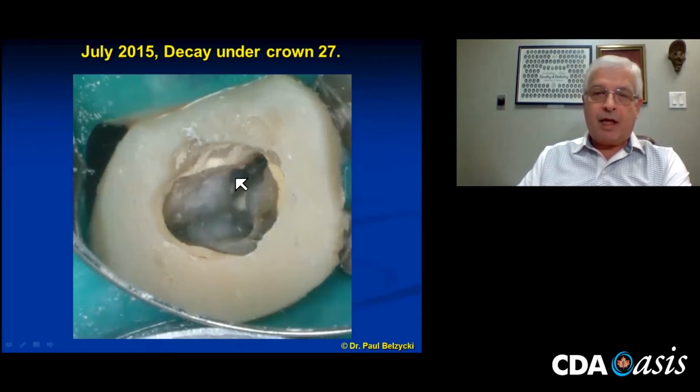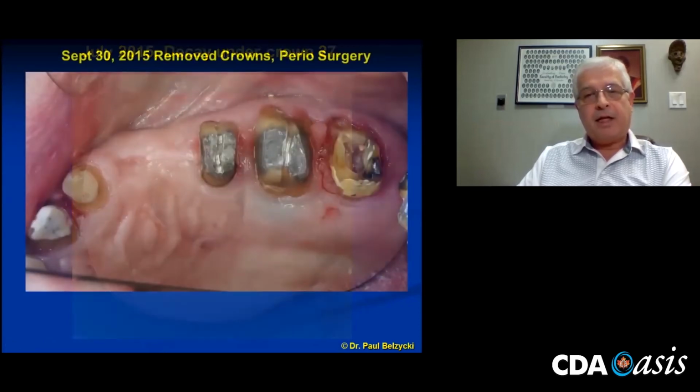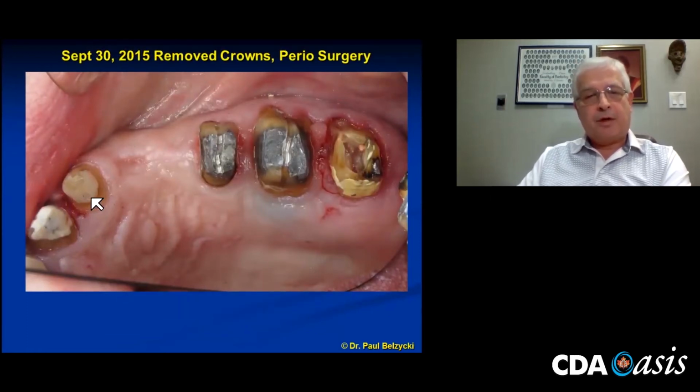And of course, it aids in finding two mesiobuccal roots when you have good light and good visibility. God forbid just to have one major mesiobuccal, but he had two, and there was the palatal canal, and the endo was carried out. And now it was time to restore the area.